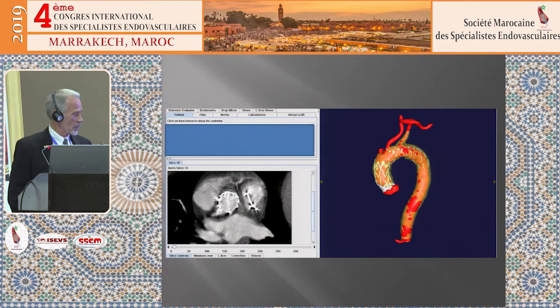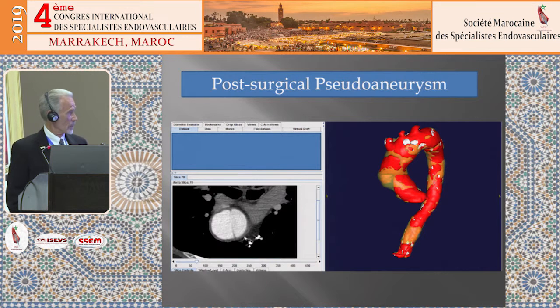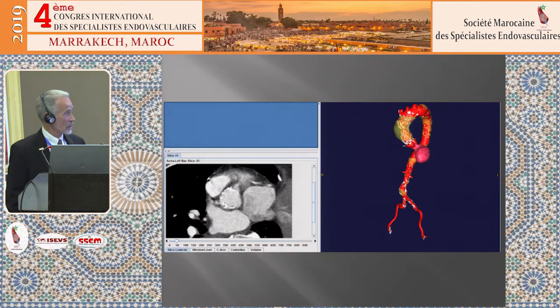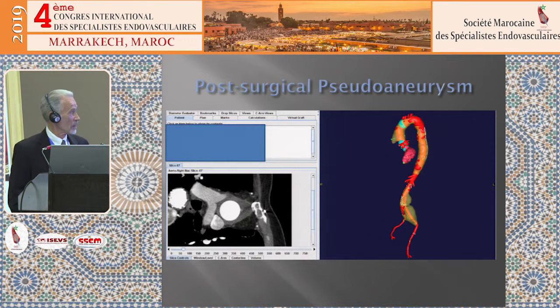And this is that same patient. We have some now out to 4 years to be able to look at how that anatomy heals and whether these are stable. Another example of a patient with a post-surgical lesion, covering that with the endograft, and then again serially imaging out to, in this case again, 4 years to be able to see how that aorta remodels and what the device stability is.